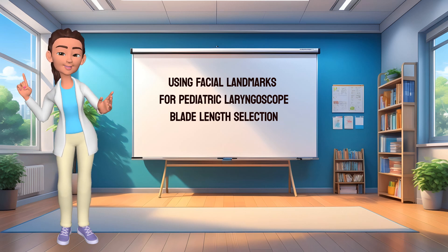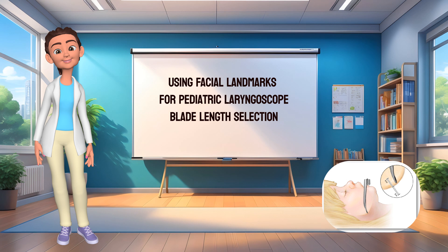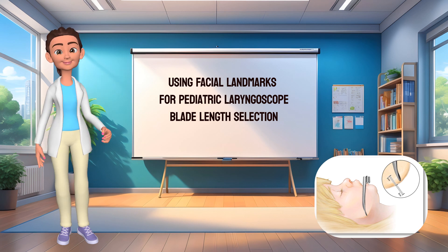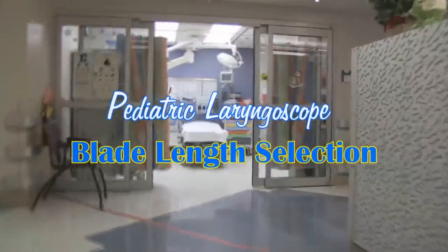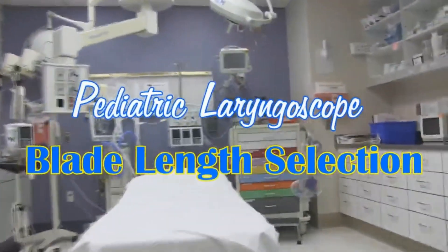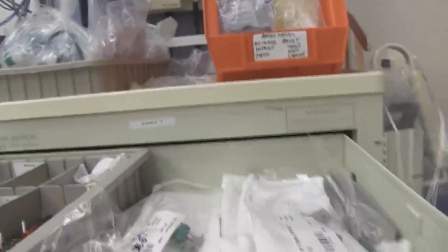Hey everyone, I'm Freya, and Dr. Mellick has asked me to help teach about using facial landmarks to choose the correct pediatric laryngoscope blade length. You have a pediatric trauma coming in — it sounds like a child under three years of age. The child is going to need to be intubated. What is the correct blade length size you will need for your laryngoscope?